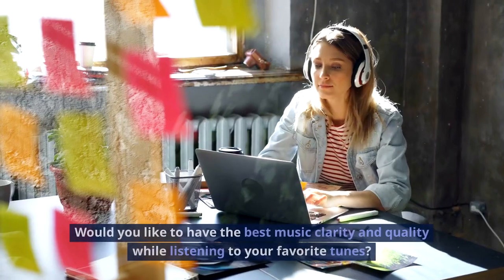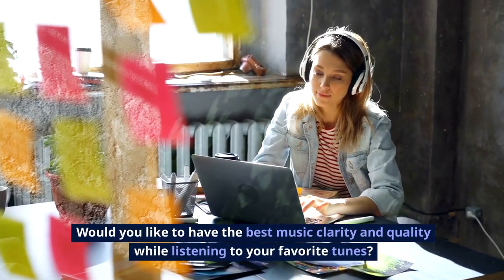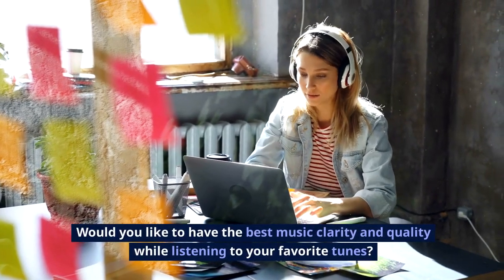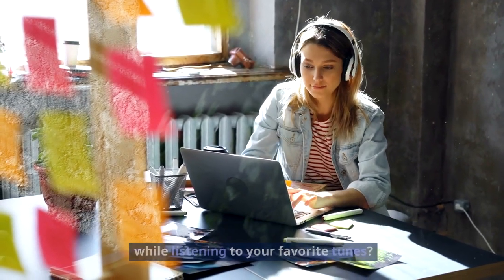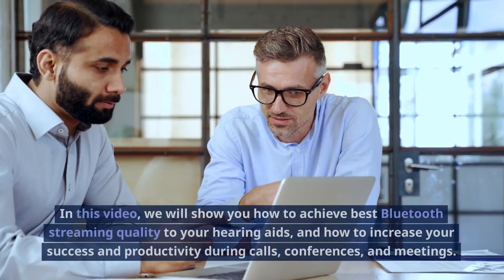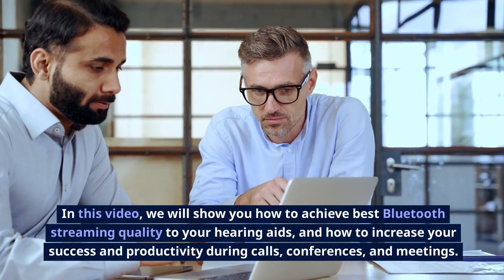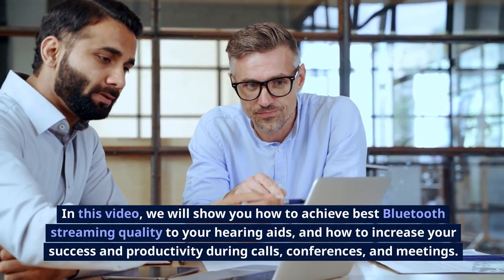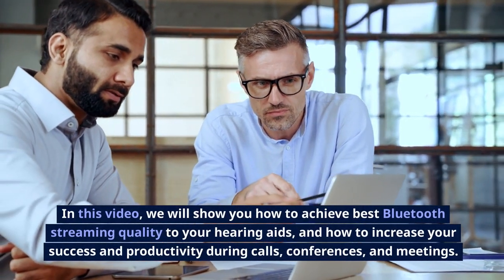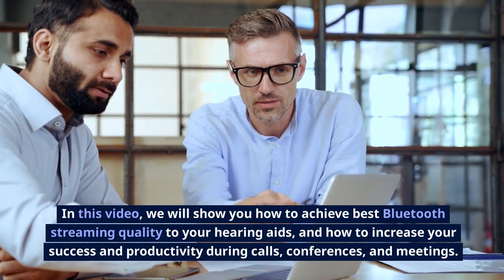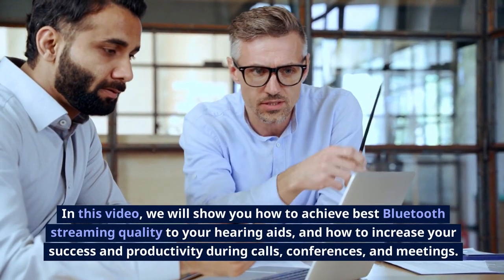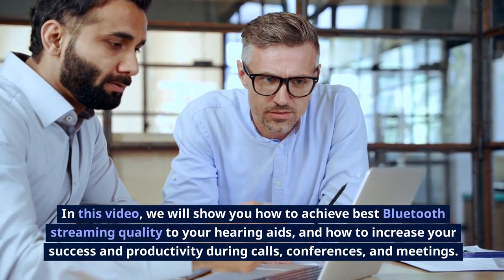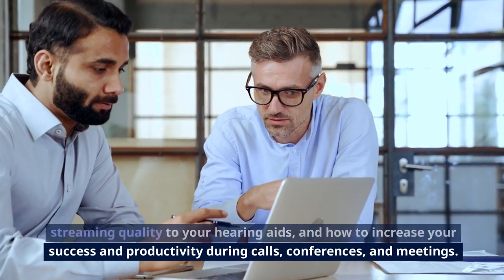Would you like to have the best music clarity and quality while listening to your favorite tunes? In this video, we will show you how to achieve best Bluetooth streaming quality to your hearing aids and how to increase your success and productivity during calls, conferences, and meetings.